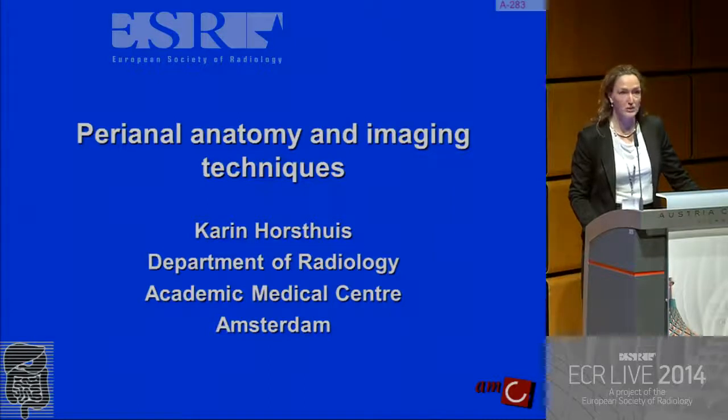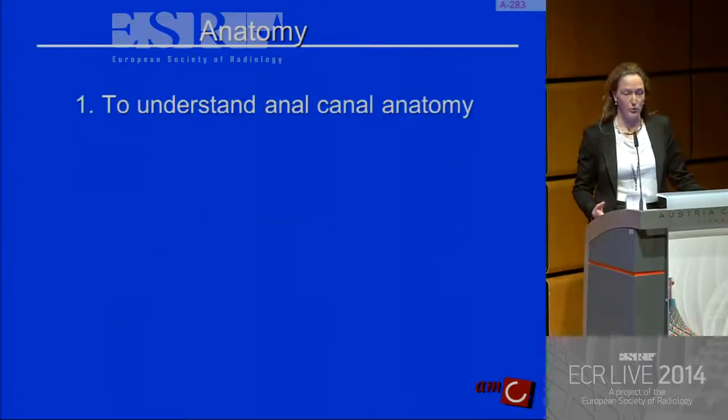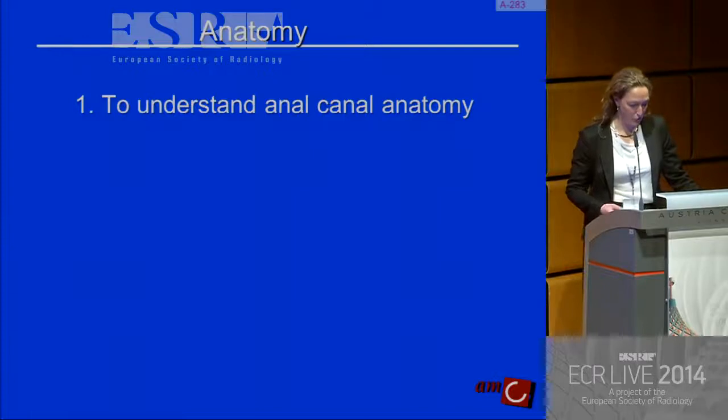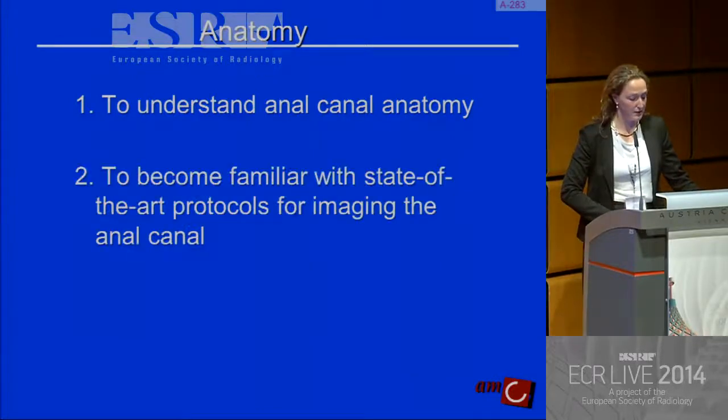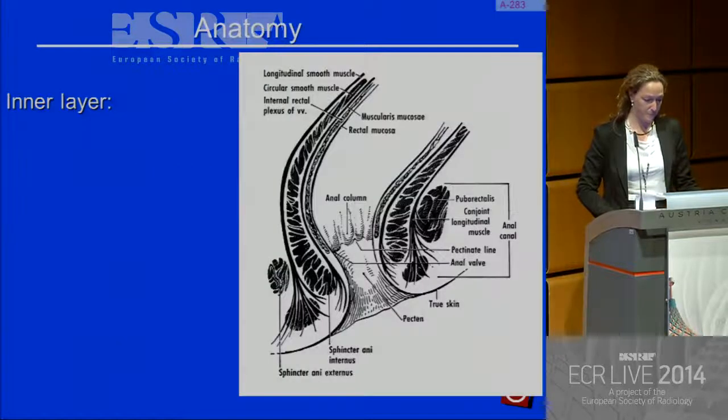In the following 20 minutes, I will discuss perianal anatomy and imaging techniques. I will do that by, firstly, helping you understand anal canal anatomy. Secondly, I will try to make you familiar with state-of-the-art protocols for imaging the anal canal. And thirdly, I will try to teach you a little bit about normal variants that mimic anal disease.